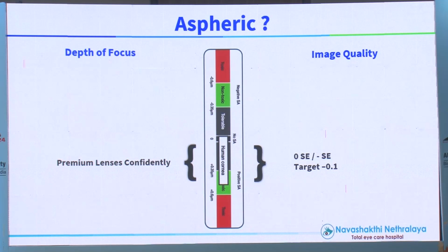Cornea, let us say, is 0.5. We have to use a lens with a spherical aberration of 0.27. The highest we have is 0.27. I'll be coming to that. So, 0.5 and 0.27. We have brought it down to almost 0.13 to 0.2, closer to 0.1. So, we are targeting crispness, but multifocality is provided by other technology.